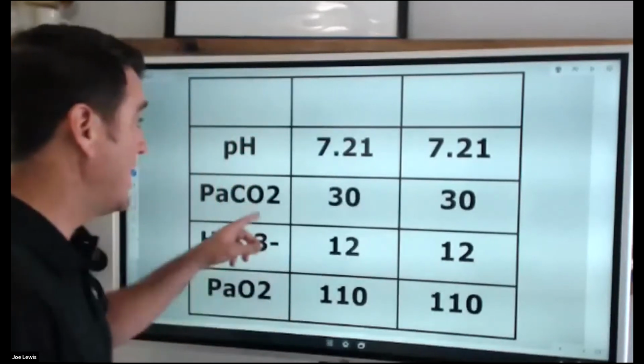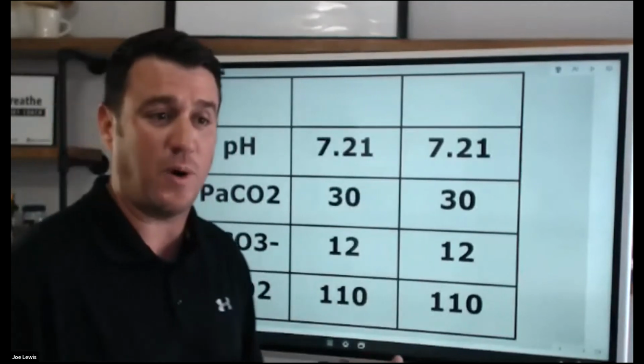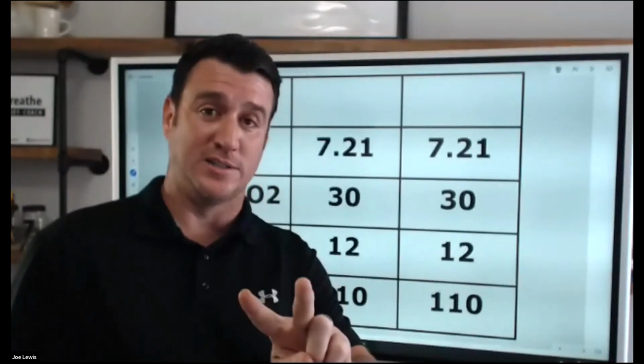Okay, but I'm going to give you some bonus material here, and we're going to talk about metabolic acidosis. So let's look at this here real quick. This is the same blood gas. Like, why do you have it up there twice? Because it can be different. This blood gas looks identical, but there can be two different causes of this blood gas.